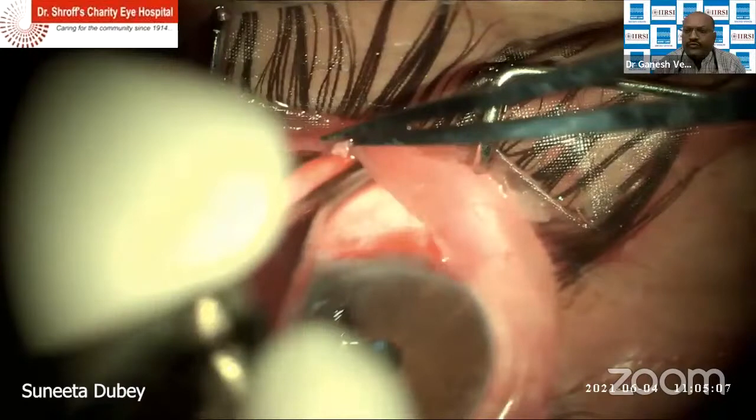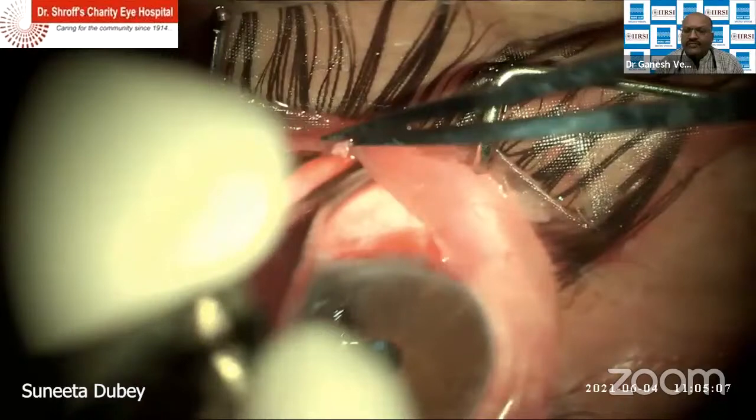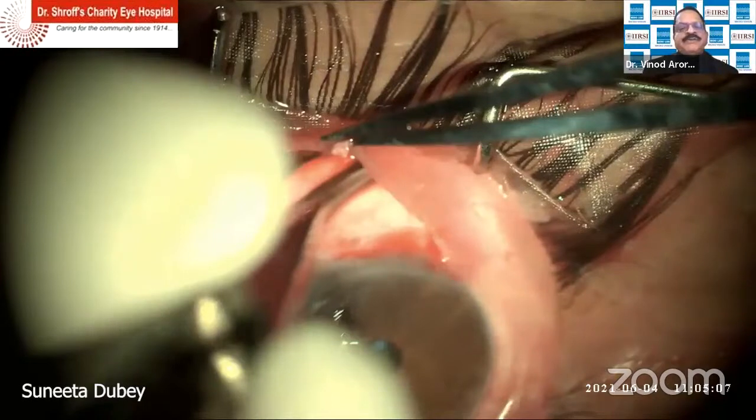If I may add one more point to that, Dr. Murli, you shouldn't suture the conjunctiva to the Ologen either. Absolutely, because it causes a nidus for infection. So make sure the suturing of the conjunctiva is done separately from the Ologen area. Left alone, yes.